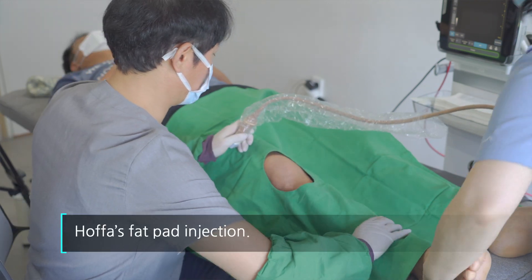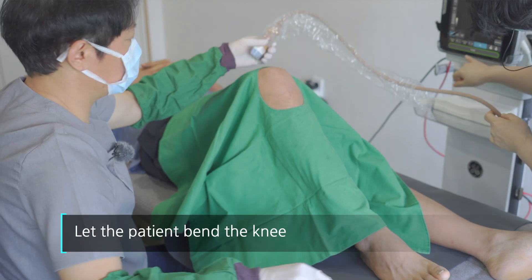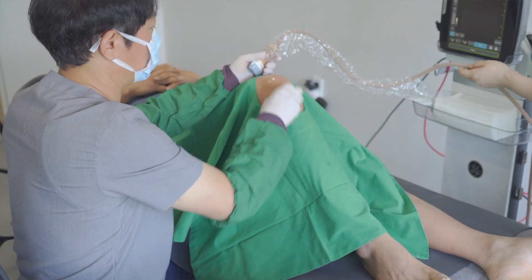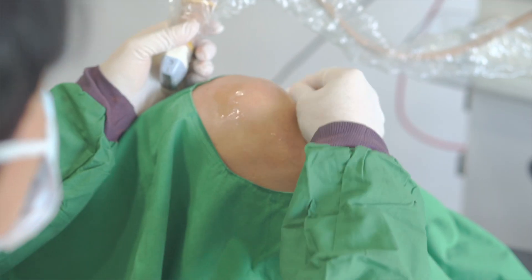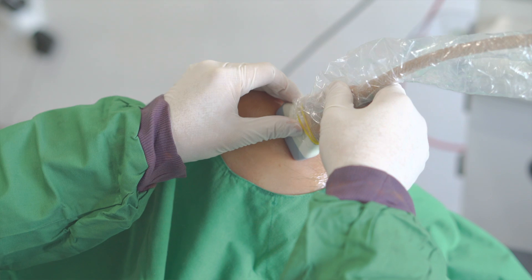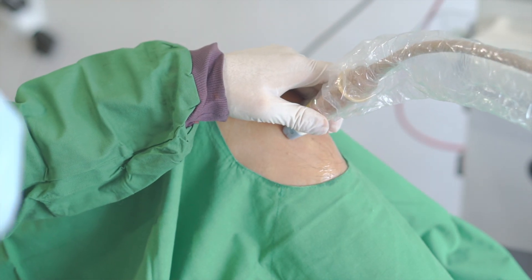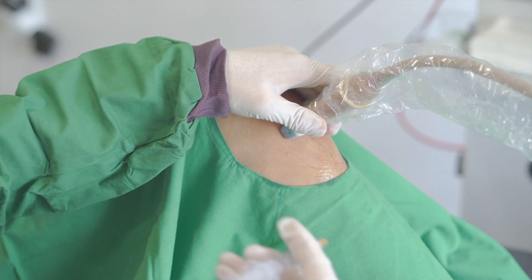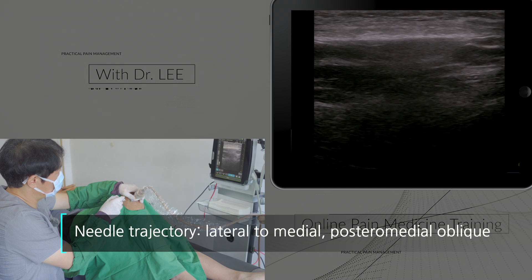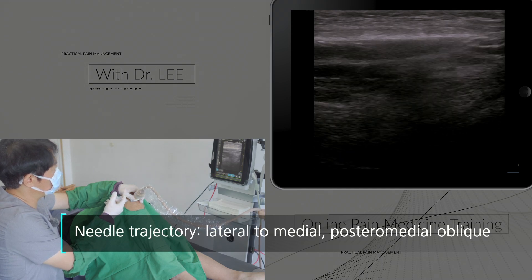This approach is the Hoffa's fat pad injection. As the patient bends the knee, I put a needle at the lateral aspect of the knee and approach the needle from lateral to medial posterior.